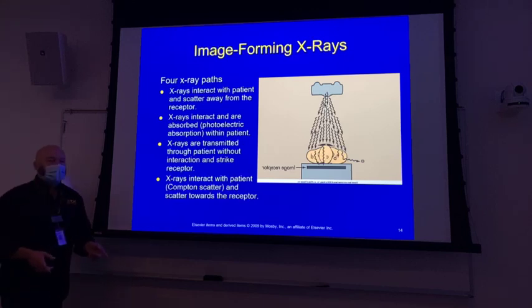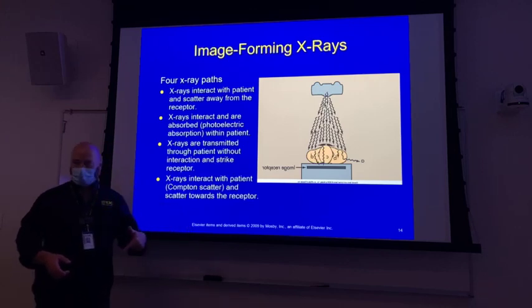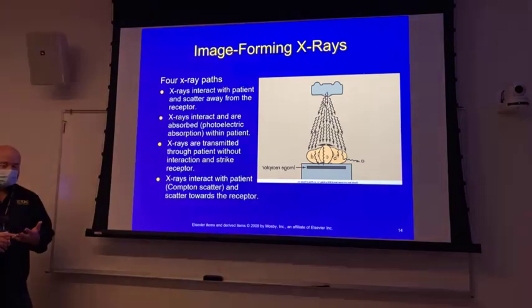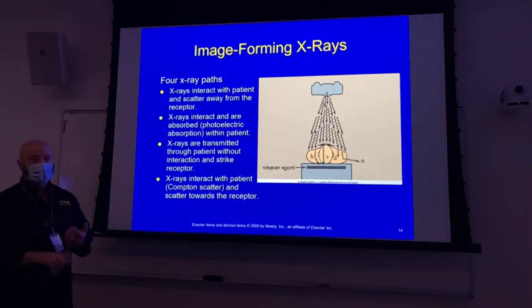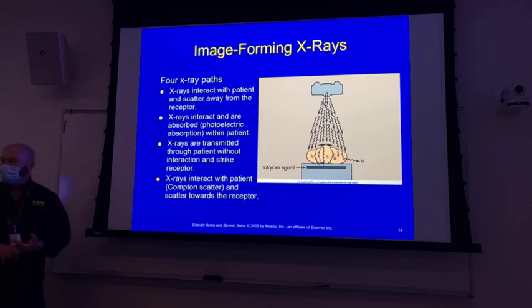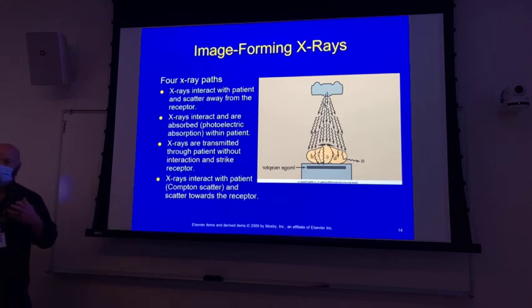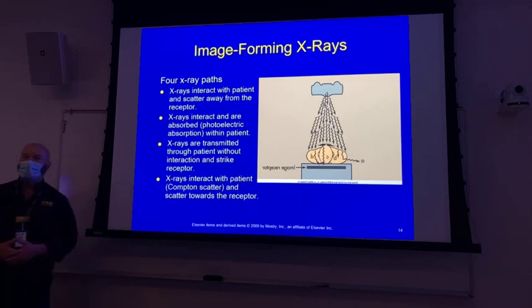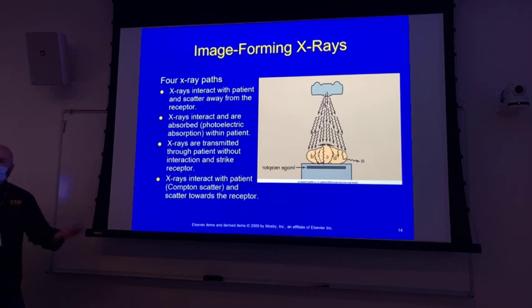The scatter radiation, the Thompson, if it exits the patient, it's also going to hit the image receptor. And it's going to put a layer of fog down, but 2 things about Thompson. One is it's very low energy, and it parallels, well, 3 things really. It parallels the transmission almost exactly, so it's pretty much inseparable from the transmission. All right, so those 2, plus it accounts for a very small portion of the remnant beam. So we don't talk about it a whole lot because it's almost indistinguishable except for energy level from transmission, okay? So it almost doesn't matter.